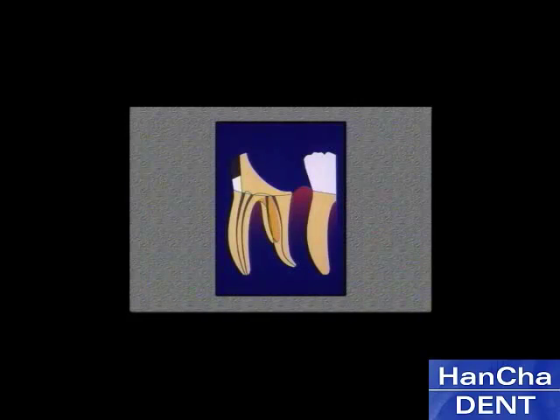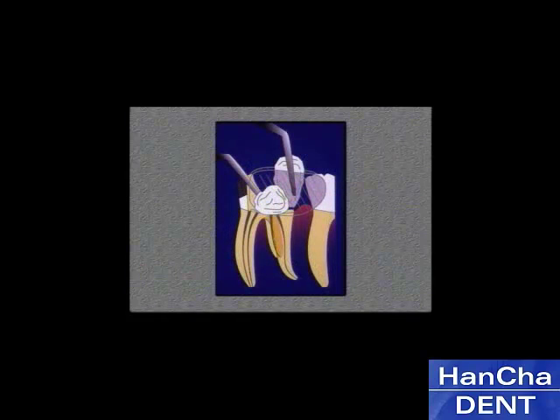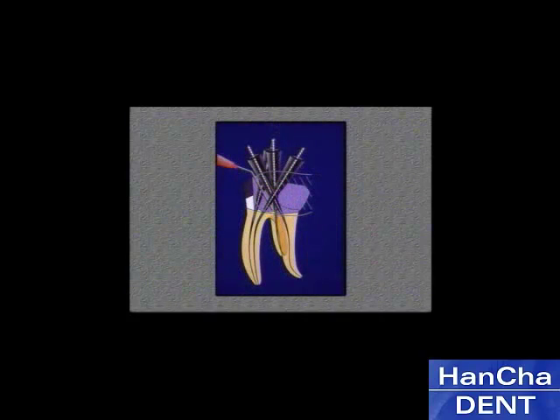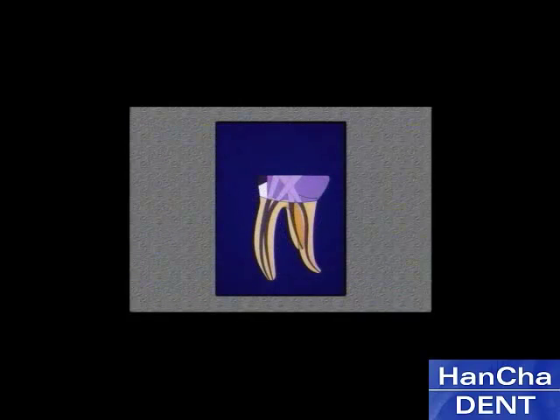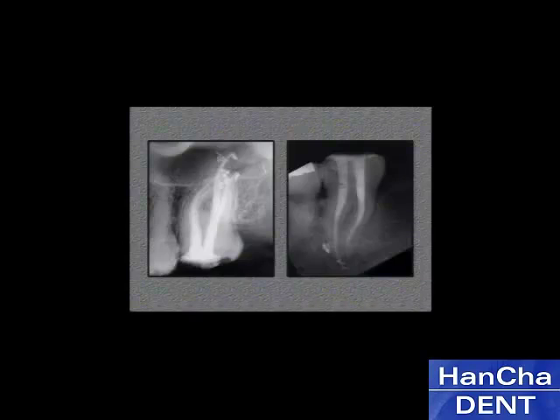Virtual projection of the orifice from the chamber floor to the cavo surface of the access cavity would offer direct and unimpeded visualization of and access to the projected orifice, while also providing quick and reliable isolation. The resultant simplification of otherwise complex endodontic procedures would significantly decrease treatment time while rendering a more superlative clinical result.